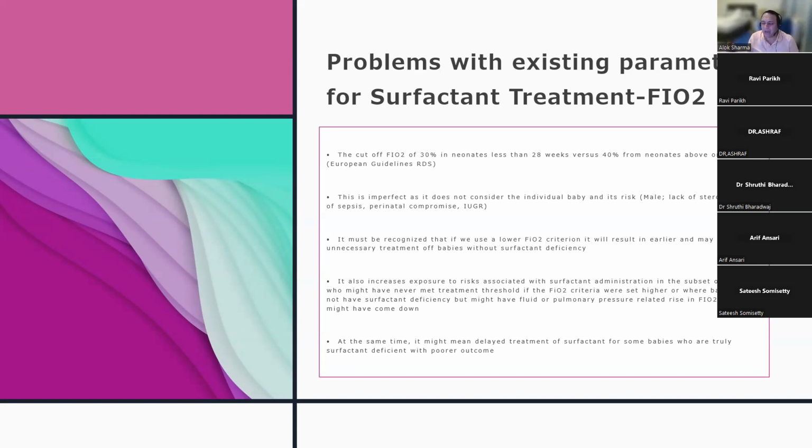Really, handling lines, all of those things often meant that the effective delivery of PEEP to keep them well recruited, the effective delivery of CPAP, was a real struggle. And the more preterm the baby, again, prong sizes, having the ability to keep an uninterrupted seal was a real challenge in the first few hours.